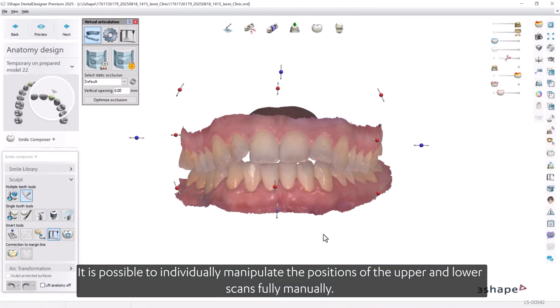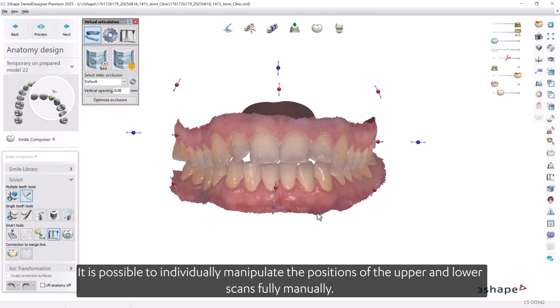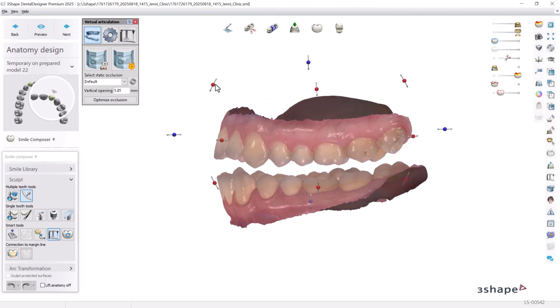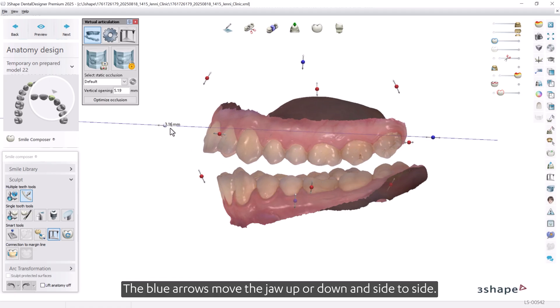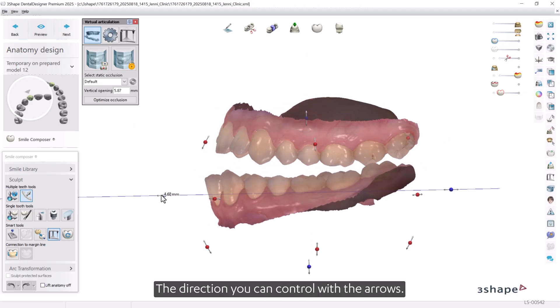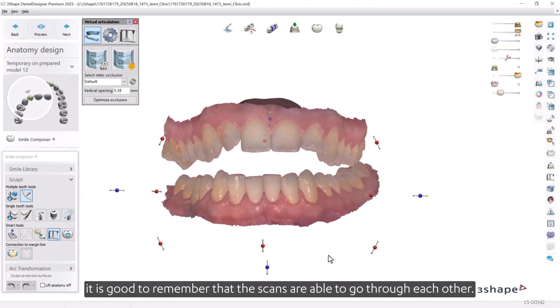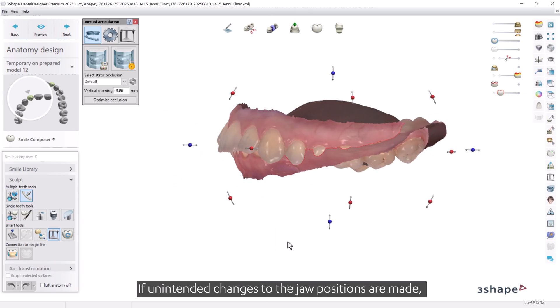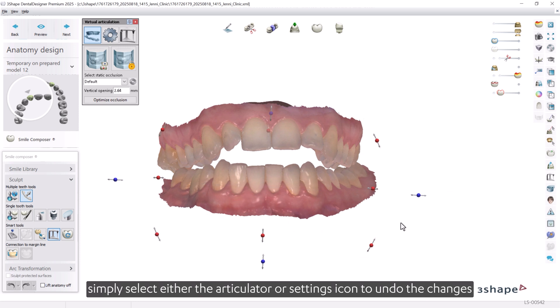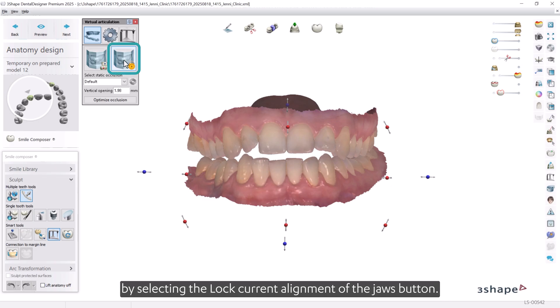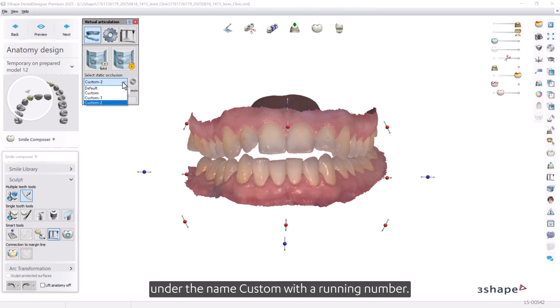It is possible to individually manipulate the positions of the upper and lower scans fully manually. Each of the scans is equipped with a set of control arrows. Start by left-clicking on the scan you would like to move. The blue arrows move the jaw up or down and side to side. Red arrows control the rotation of the scan; the direction you can control depends on the view direction of the model. When moving the jaw, be aware that the scans are able to go through each other. If unintended changes are made, simply select either the articulator or settings icon to undo the changes. When satisfied with the positioning, you can save the new bite by selecting Lock Current Alignment of the Jaws. This will create a new bite in the Static Occlusion menu under the name Custom with a running number.